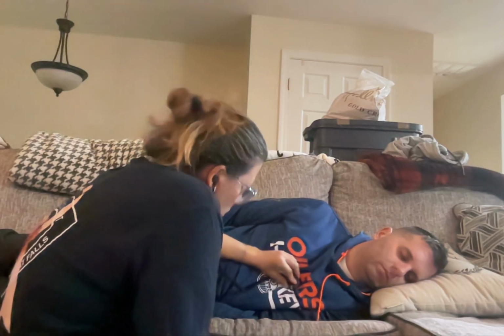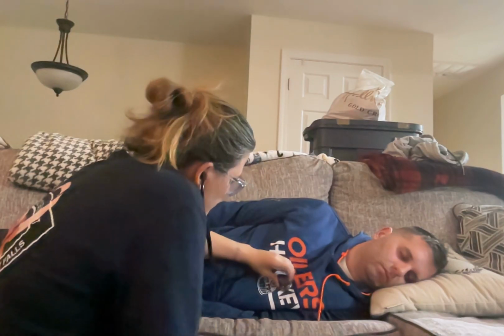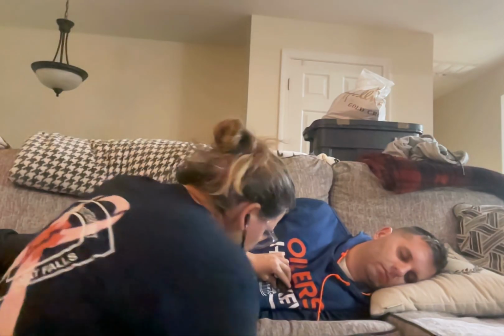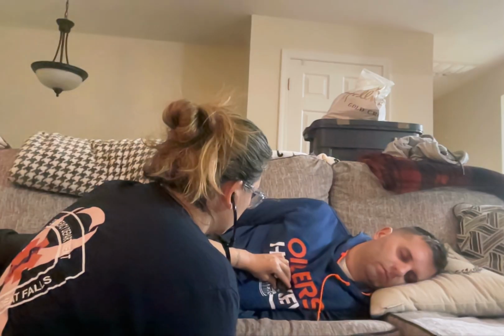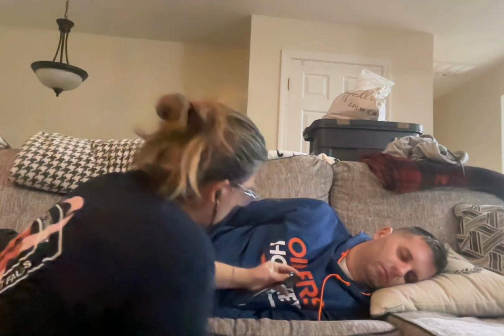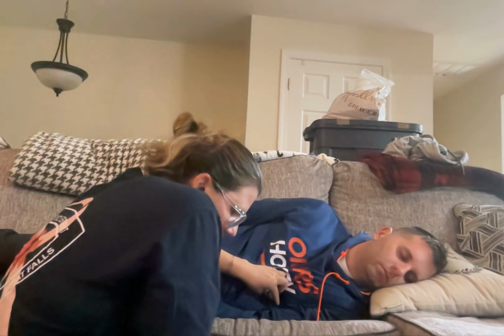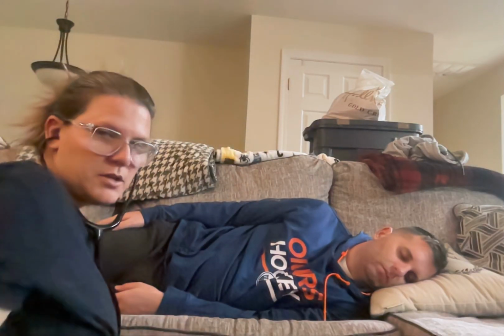And I would go down 1 to Erb's point at the 3rd intercostal space. And I'll go down 2 to the 5th intercostal space and listen for the tricuspid valve. And then I'm going to come to the mid-clavicular line and listen for the mitral valve. I'm going to turn this over to my bell, and I'm going to do this over again.